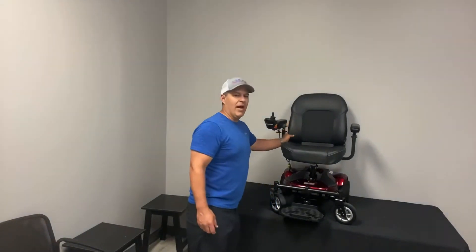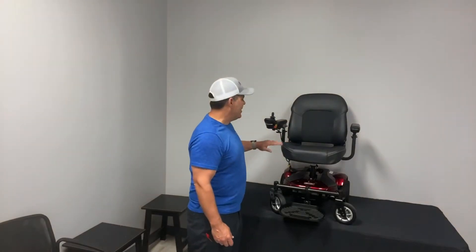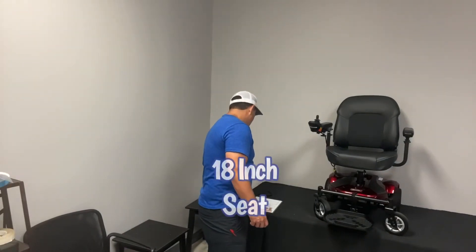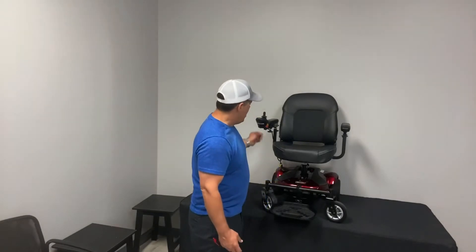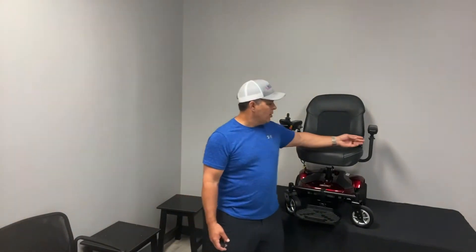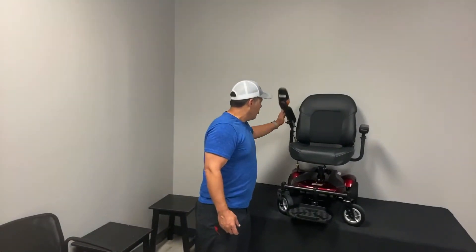What's unique about it is that it has a taller back than most of your industry standard portable power wheelchairs — an 18 inch height. Your actual seat width is 18 by 16, so it's an 18 inch seat width. The joystick can be put on the right or left hand side, depending on which one you need.